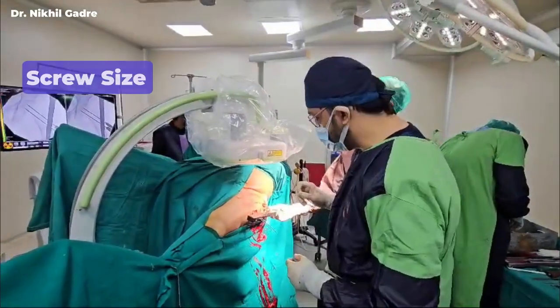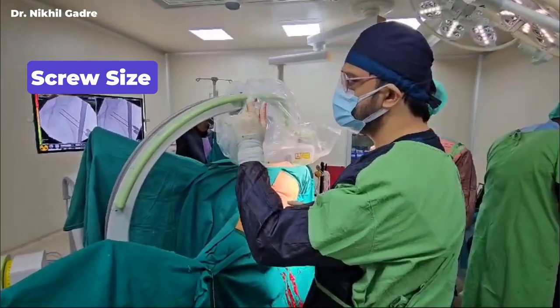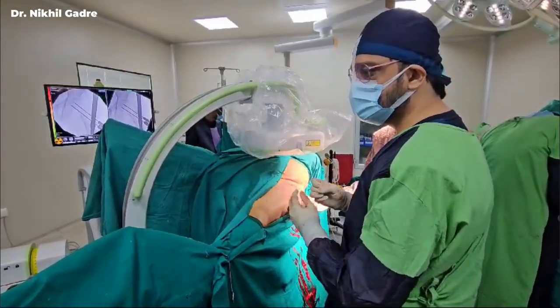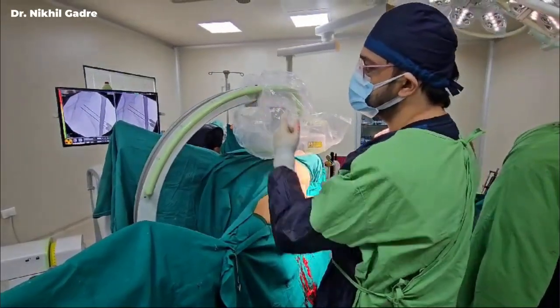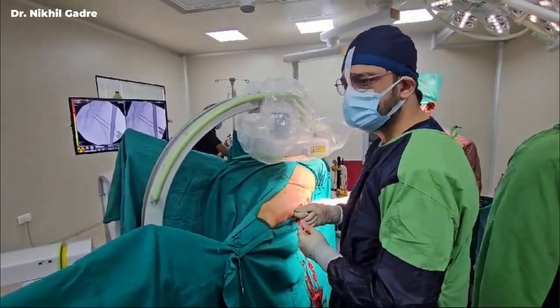The sizing of the screws depends on two things. One, it should be about 10 mm from the subchondral bone. It should have very good hold. Even if you want to go deep and leave less gap between the subchondral bone and the screw head, it's okay, but it should have a good hold. Second, it also depends on the amount of distraction you have at the fracture site. In our case, it's not much distraction, so a lesser amount of traction needs to be released.